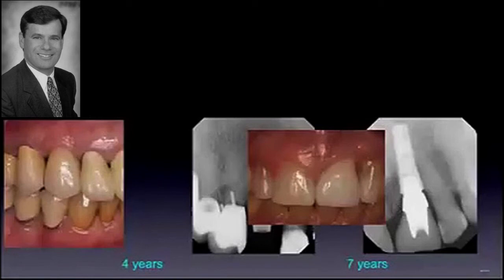But reality is, this is 7-8 millimeter pockets, significant exudate, significant issues relative to it, and occasionally an abscess. And that's when she comes in and she says, you know, this thing is swollen on me. But it really is not due to the design feature of the implant itself. It's more that it's using an implant designed for a crestal application and placing it subcrestally.